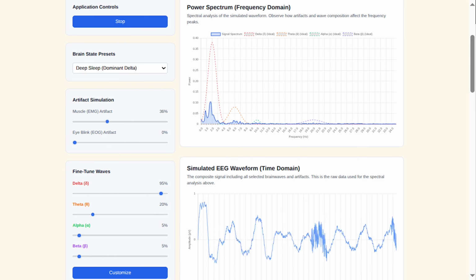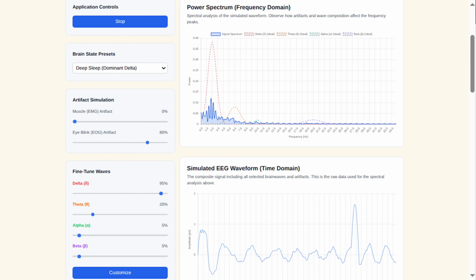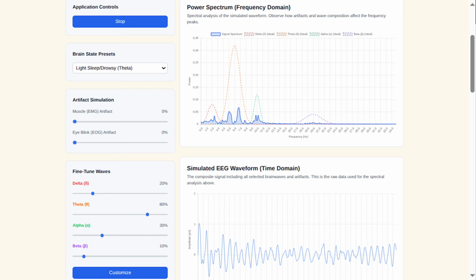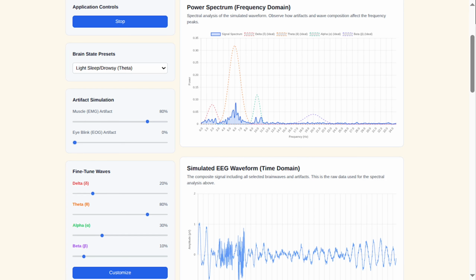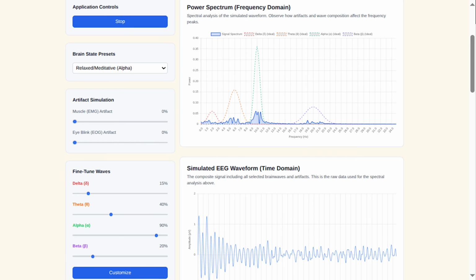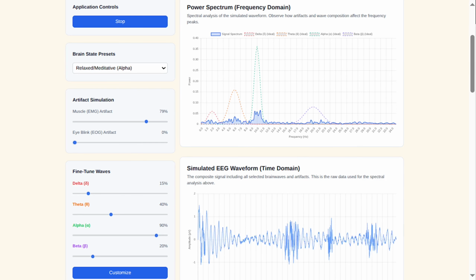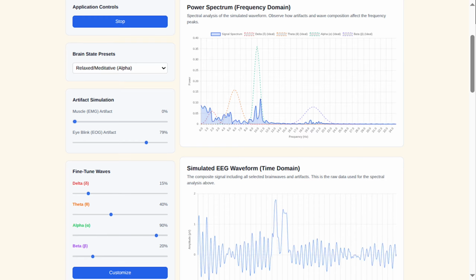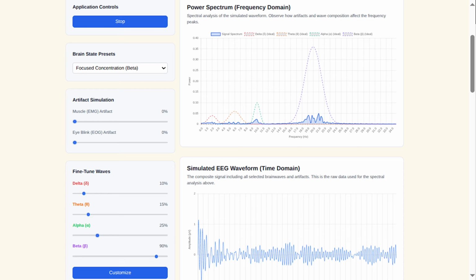Okay, so you mentioned subcutaneous electrodes, also the subdermal electrodes. What's the difference, and is there another term that can be used? Subdermal and subcutaneous electrodes refer to the same thing, placed just under the skin. Another term sometimes used is percutaneous electrodes. The main difference is in placement depth. Subdermal is just beneath the skin, while intracranial electrodes go deeper into or onto the brain surface. Okay, so we have subdermal, subcutaneous, and percutaneous, whatever.